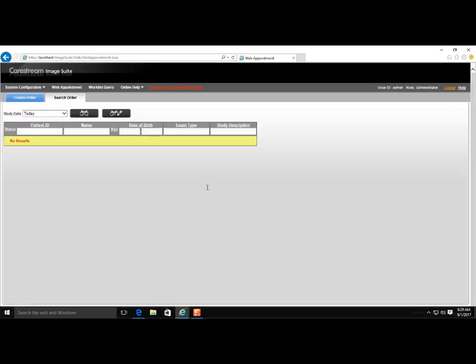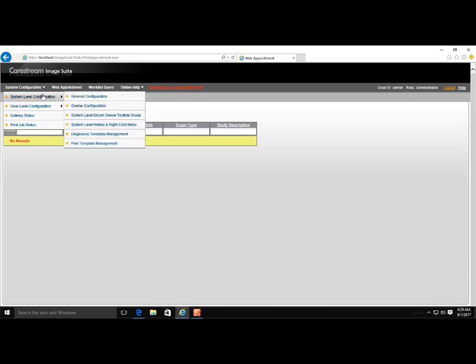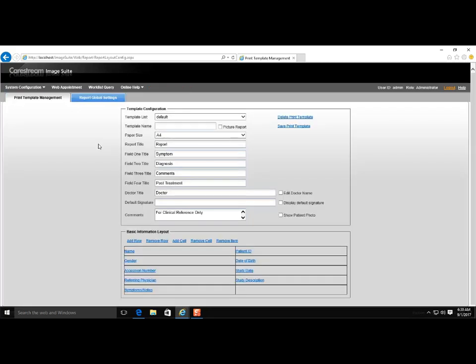Hover over Systems Configuration in the upper left, then move to System Level Configuration, and a new drop-down appears. Choose Print Template Management.